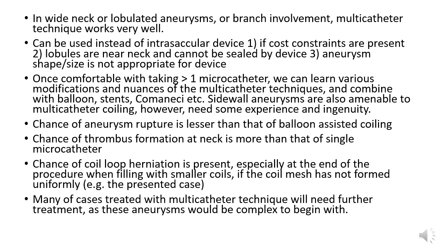Most of it will come in your subconscious mind as you keep on doing things, and no one can really teach this. There are some techniques obviously, but it's better that you just start it and keep doing it, and then you can combine it with balloons, stent, other devices like Comaneci temporary, the neck remodeling devices, etc.